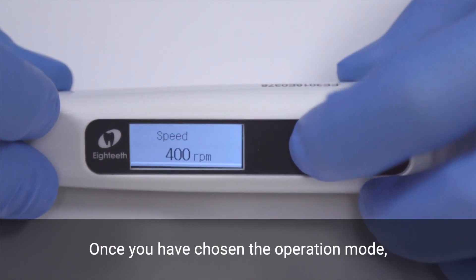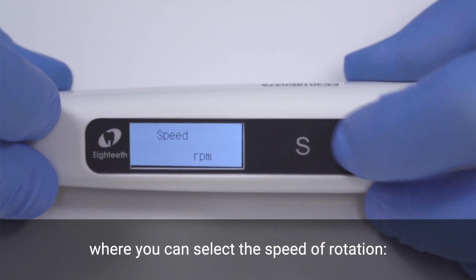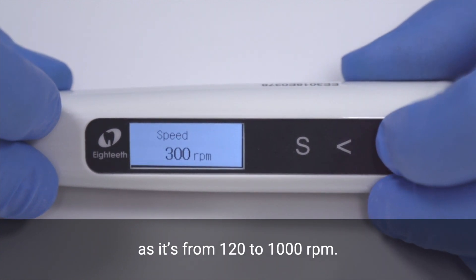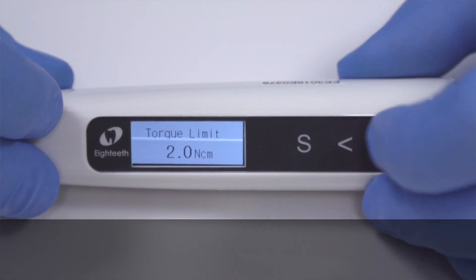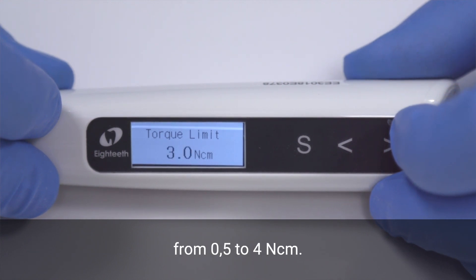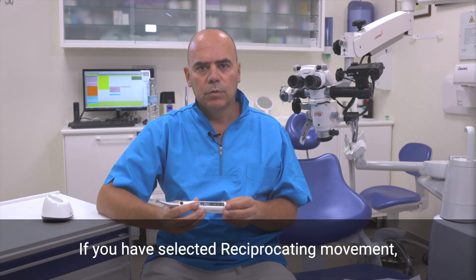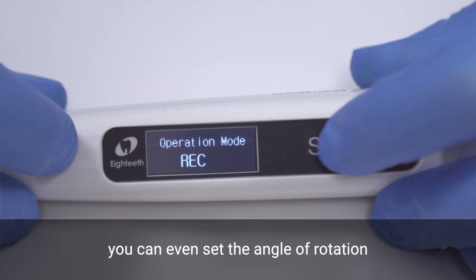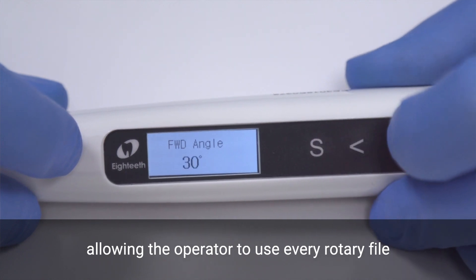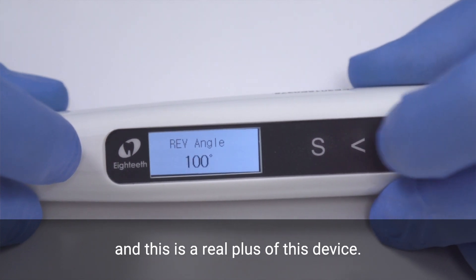Once you have chosen the operation mode, by pressing the S key you move to the next window where you can select the speed of rotation. The range is really wide, from 120 to 1000 rpm. Always by pressing the S key, it's possible to set the torque from 0.5 to 4 Ncm. If you have selected reciprocating movement, you can even set the angle of rotation from 30 to 370 degrees, allowing the operator to use every rotary file in reciprocating motion — and this is a real plus of this device.